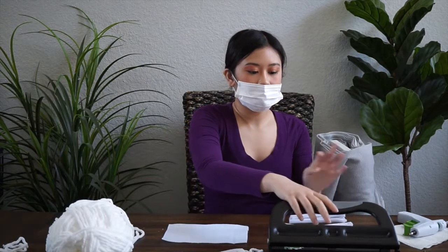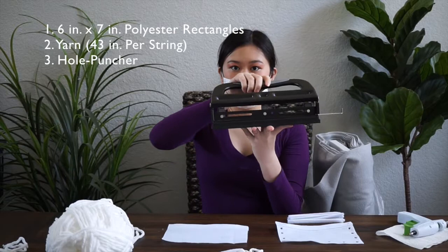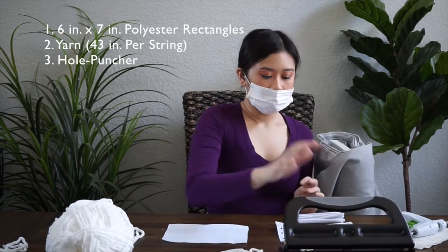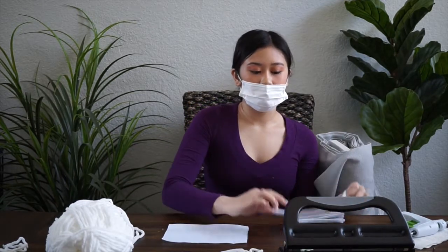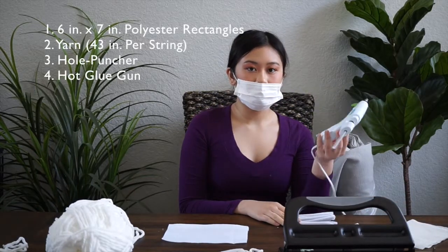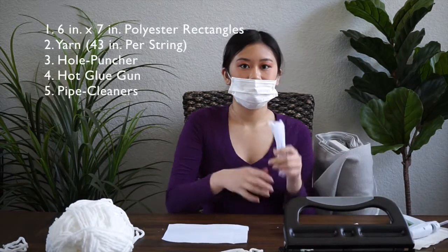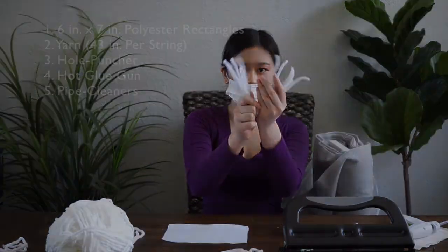And then you're also going to need to punch holes through the sides that the strings can go through. And one of the easiest ways we found out we can do it is by using one of these big hole punchers. You could probably also use a smaller one, it's just easier. And then you're also going to need a hot glue gun and some pipe cleaners, which I've cut in half.